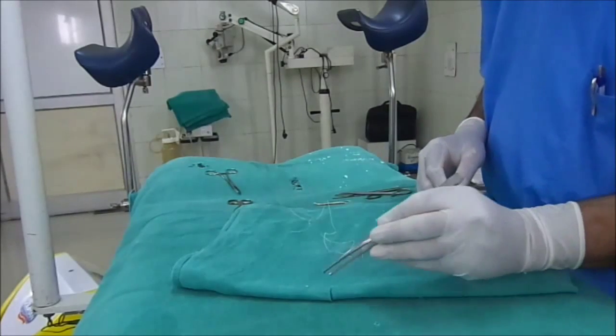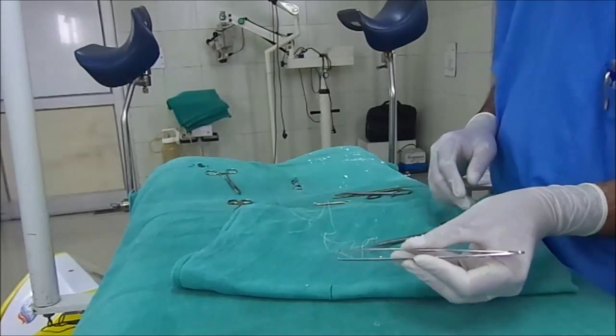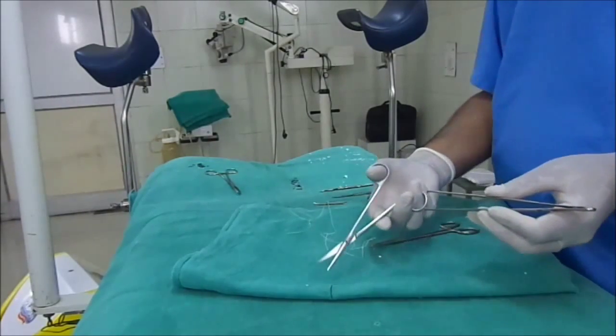The next instrument is tooth forceps. The margin of the skin or the tissue is held with the help of these tooth forceps. And this is the fine scissor.